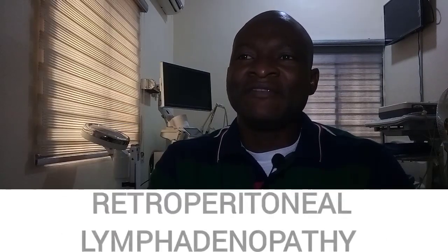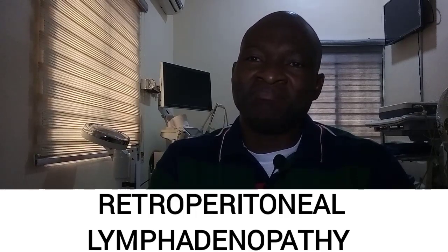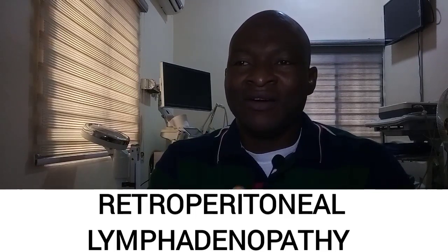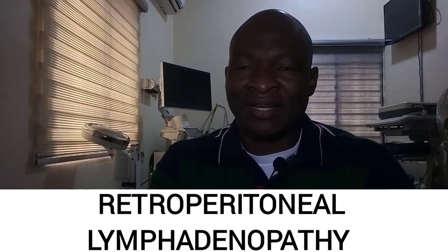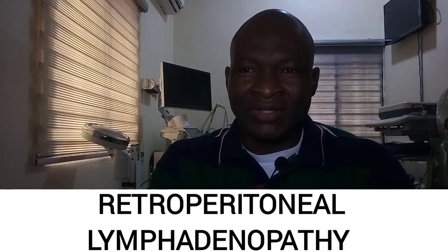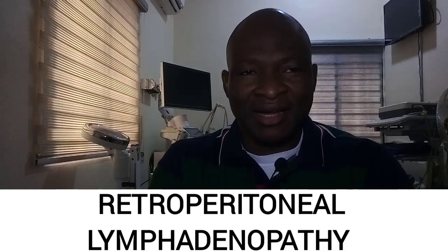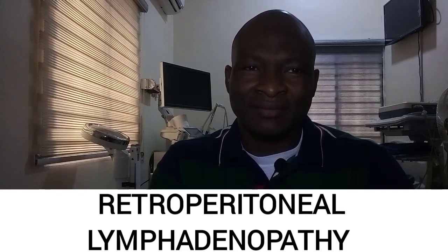So, retroperitoneal lymphadenopathy. The lymph nodes are the aortic, para-aortic, retro-aortic, or retrocaval nodes that surround the aorta, IVC, and lie anterior to the spine. Normal size retroperitoneal lymph nodes will be up to 1 centimeter in diameter and are usually not seen by ultrasound. Solitary nodes greater than 10 mm are usually seen and considered enlarged. Multiple lymph nodes that are larger than 6 mm are considered enlarged.